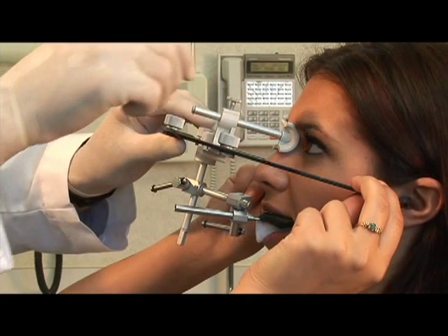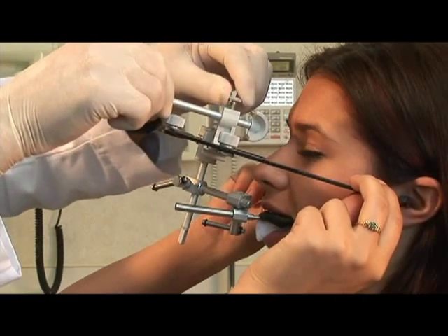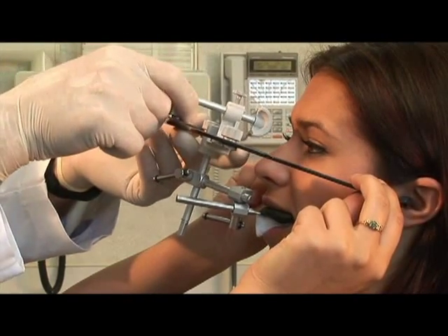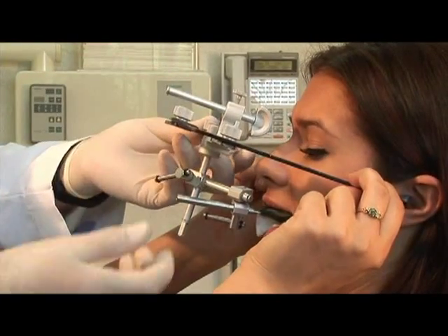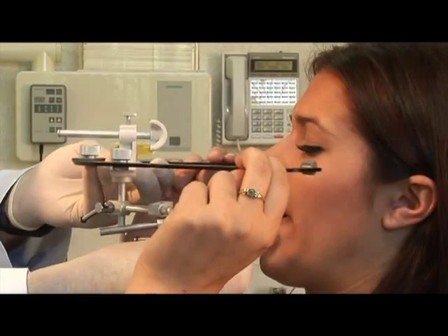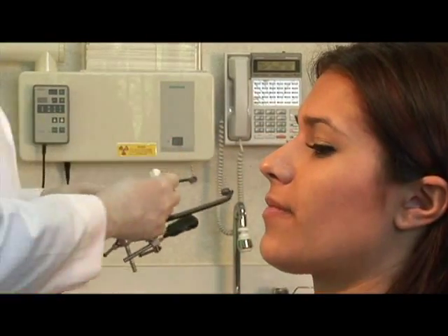While the patient stabilizes the facebow, carefully slide the nosepiece away from the patient's nose, loosen the center thumb screw on top of the facebow. The entire facebow assembly is removed by advising the patient to pull the earpieces out of the ears while helping to remove the bite fork from the mouth.